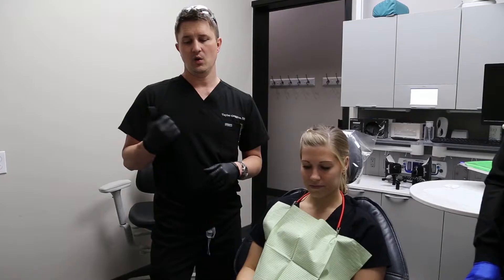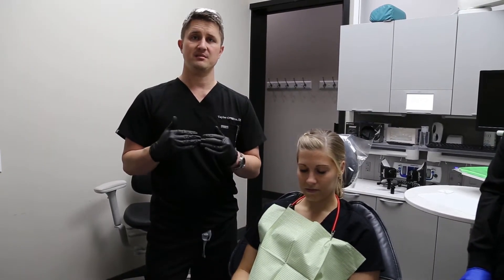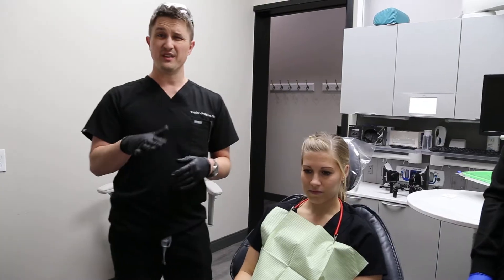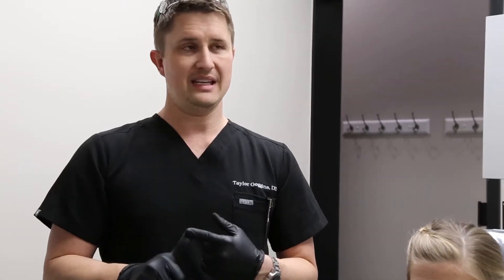We previously did a course on some of the reasons why to use a face bow. To summarize, we like to get an arbitrary mounting of the patient's maxillary arch in relation to the hinge axis. This conveys essential information from the patient — much like where their interpupillary line is, their Frankfurt plane, and their horizontal occlusal plane. This also allows ease of mounting the case and doing an assessment of their occlusion.